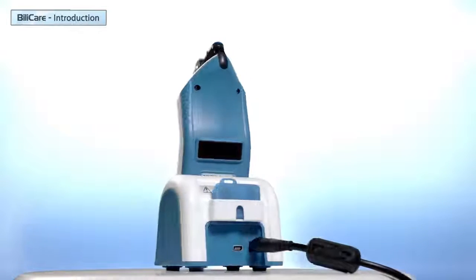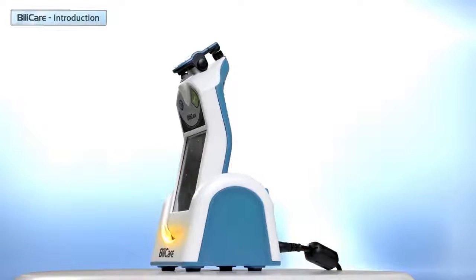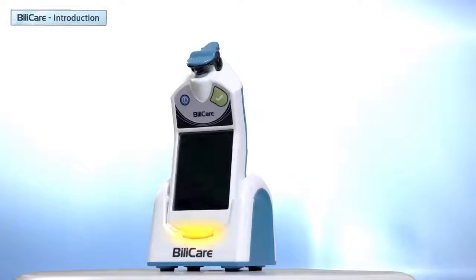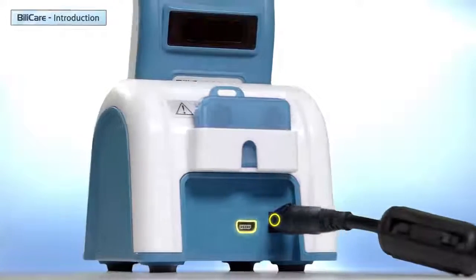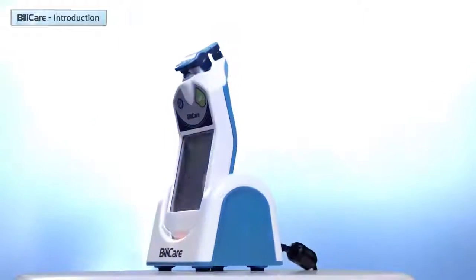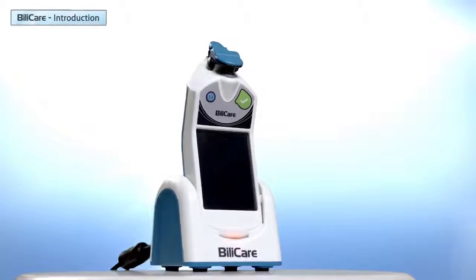Let's review the different parts. The charging stand is used to charge the device and to connect it to a computer. The orange light indicates that the device is charging. On the back side are the power supply connector and the communication connector. When not in use, it is recommended to always place the Bilicare handheld device in the charging stand.